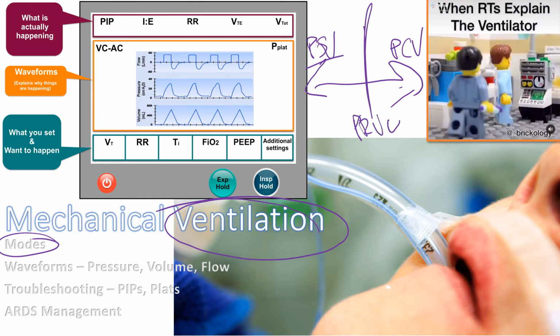Okay. So we'll be looking at the ventilator screen itself. Flow, we're not going to be worried about so much, but pressures for sure. We don't want the pressure to get any higher than 30. Then we'll start getting concerned. Sometimes with a really, really sick patient like ARDS, we'll tolerate up to 45. We'll allow it to go a little higher, but we have to keep track of those pressures to make sure it's not causing more damage to the patient, like atelectrauma or barotrauma.